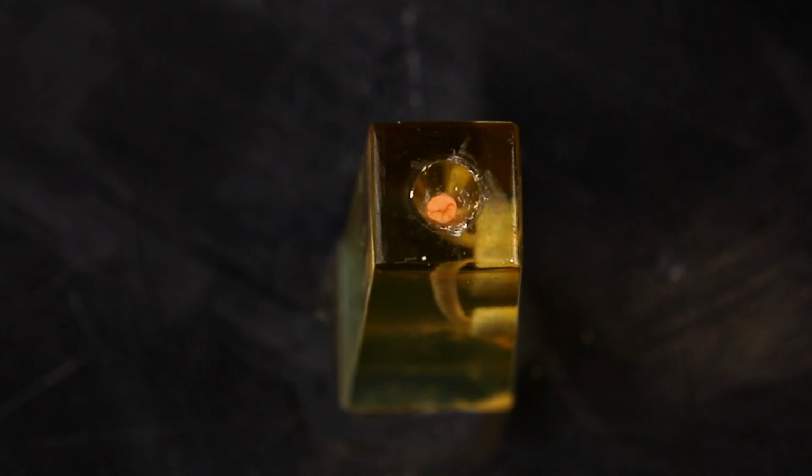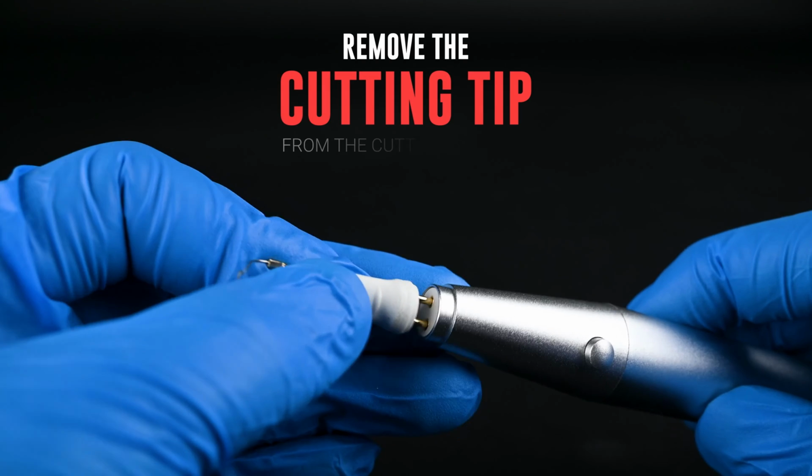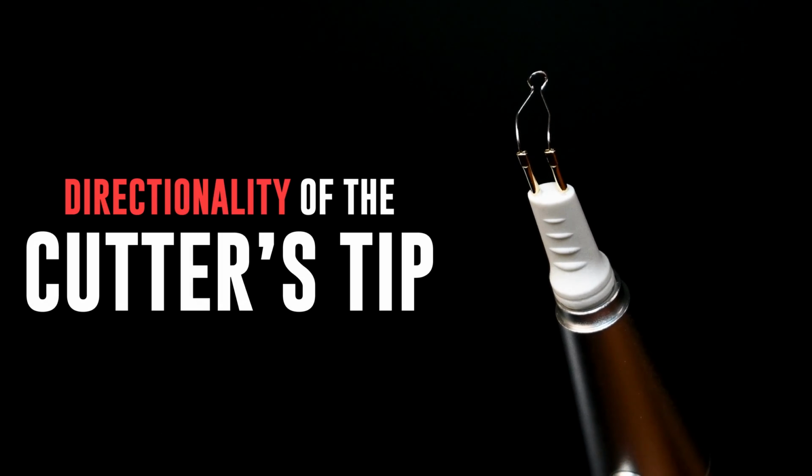After cutting the Gutta Percha, the cutting tip immediately cools down and the Gutta Percha cutter can be removed from the patient's mouth. Remove the cutting tip from the cutter after use. Inspect the cut. After cutting the Gutta Percha cone, inspect the result to ensure the desired shape and size have been achieved. Precautions: directionality of the cutter's tip.